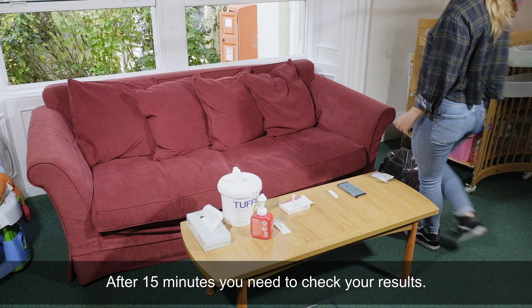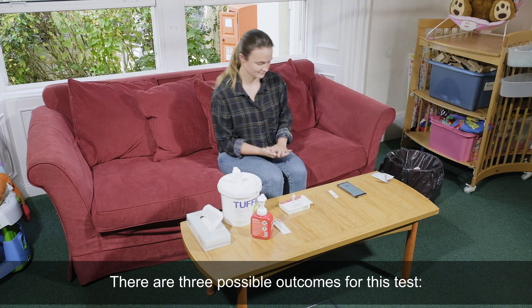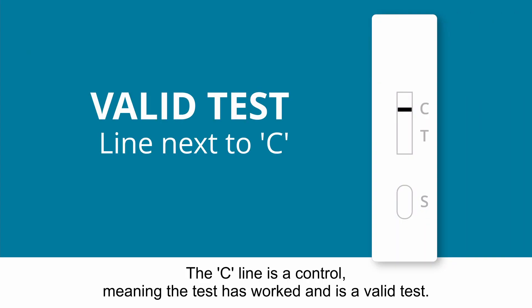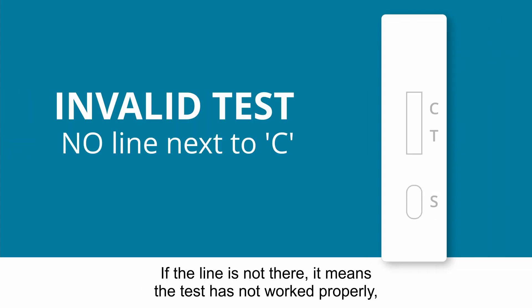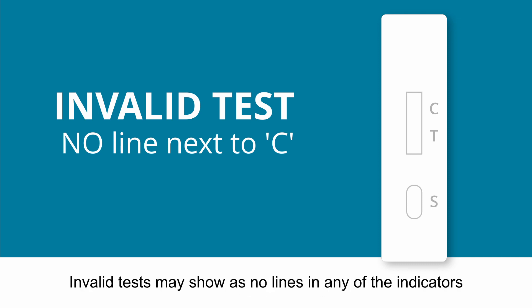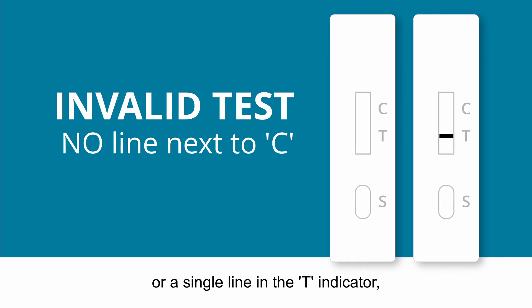It is important not to read the results before 15 minutes or after 30 minutes. After 15 minutes, you need to check your results. There are three possible outcomes for this test. The C line is a control, meaning the test has worked and is a valid test. If the line is not there, it means the test has not worked properly — you will need to do the test again, starting from scratch. Invalid tests may show no lines in any of the indicators or a single line in the T indicator. These are all invalid.